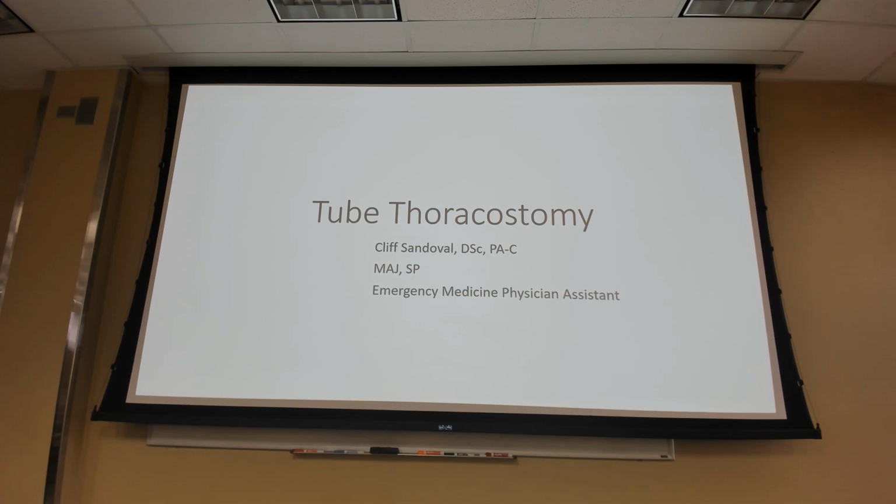We'll go over the appropriate procedure. I had some videos, but the internet is not working right now. So that's fine, you don't need one. We're going to walk you through the procedure as we do it. But the videos are in the notes section, so if you want to watch them after, I would recommend doing that, because we'll go over the technique today and why.